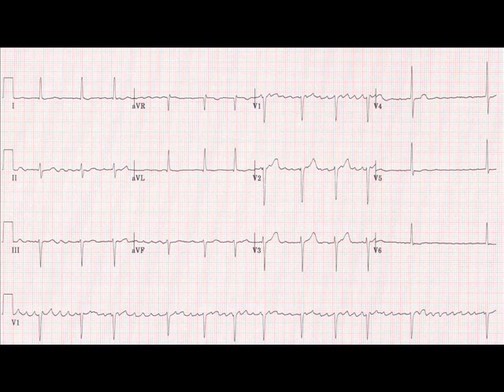However, because the electrical activity is disorganised within the atria, it travels in an intermittent fashion from atria to ventricles through the AV node. Therefore, classically, you get this variation in gaps between the R waves or the QRS complexes.